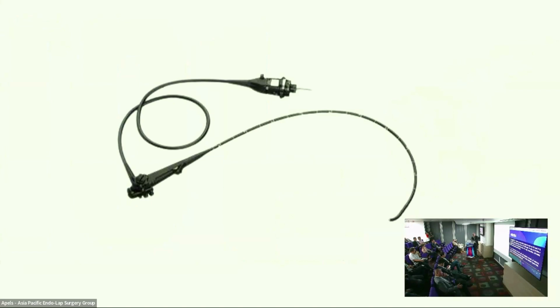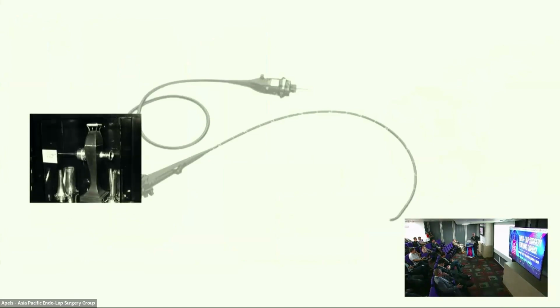And this is how it would look like, the new generation of scopes. I'll deal with it later on, part by part, or break it down slowly. But it did not start that way. It started this way. It's a very crude instrumentation where they use candles or reflected light as a light source and peep through holes without even the use of lenses.